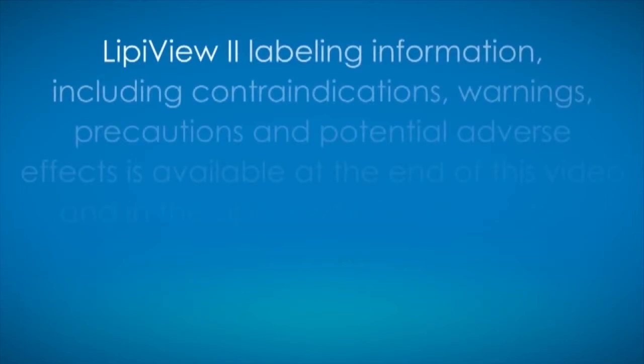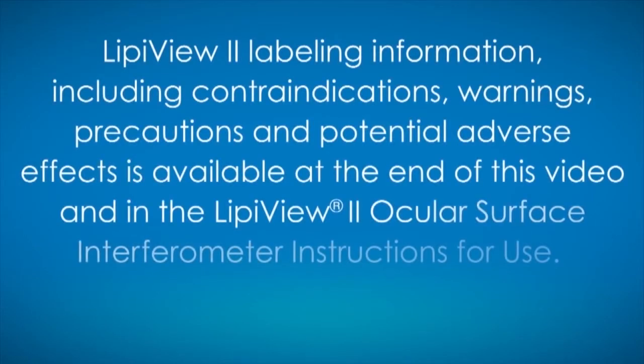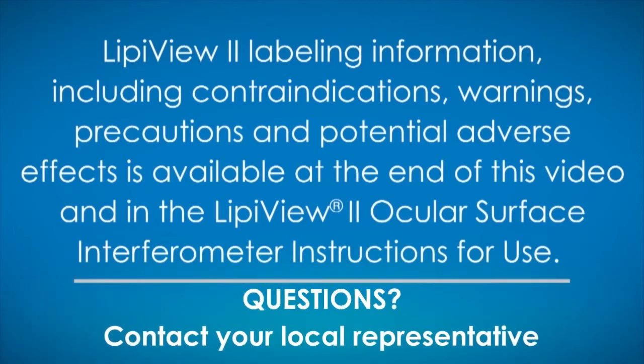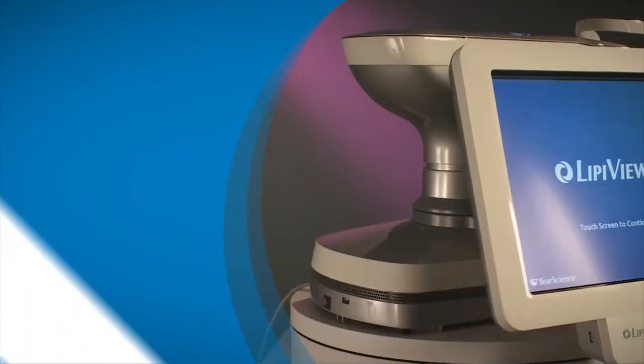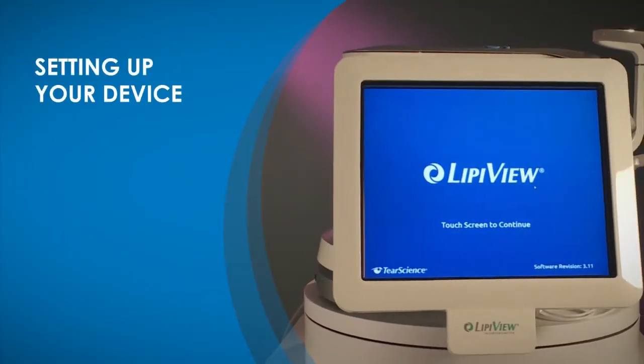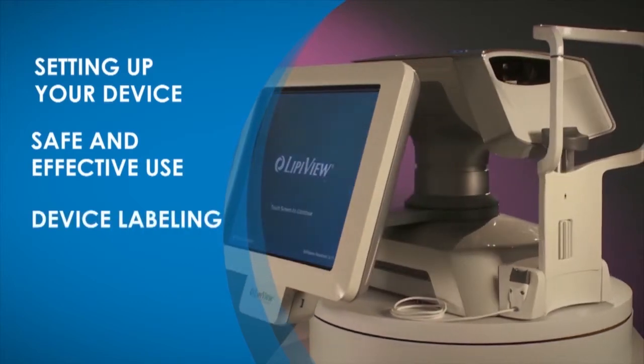LipiView 2 labeling information, including contraindications, warnings, precautions, and potential adverse effects, is available at the end of this video and in the LipiView 2 Ocular Surface Interferometer instructions for use. If you have any questions, please contact your local representative. In this video, we will review device setup, safe and effective use, and device labeling.